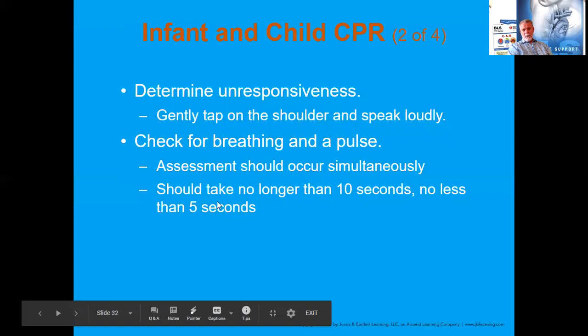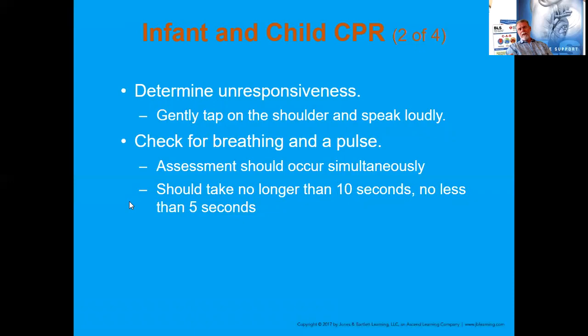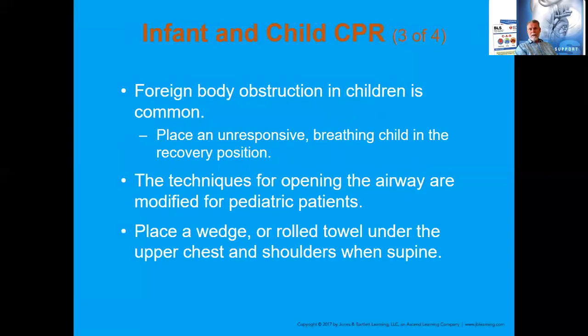I added this for you, because all it did was say, check the pulse for 10 seconds. Well, as long as you're meeting the standard through AHA and NREMT, if you say, I'm going to check the pulse for no less than 5 and no more than 10 seconds. And again, these things are done simultaneously, breathing and pulse check. Good thing to practice when we get into class if it's been a while since your CPR, but it definitely comes up on the AED skill station.